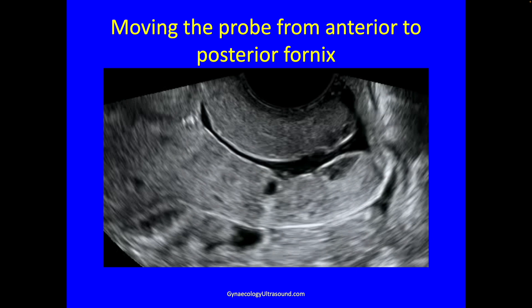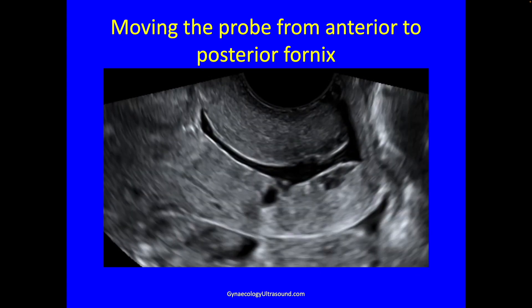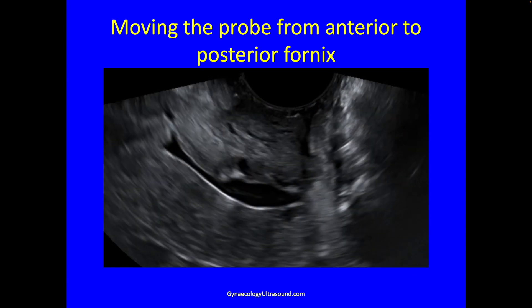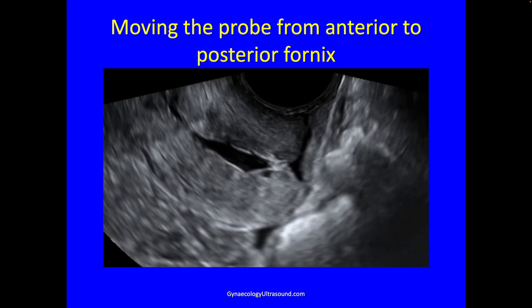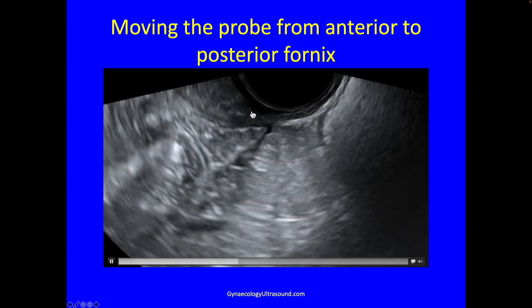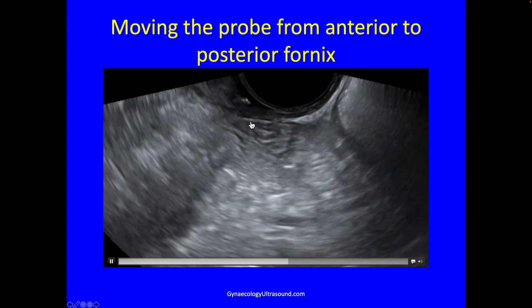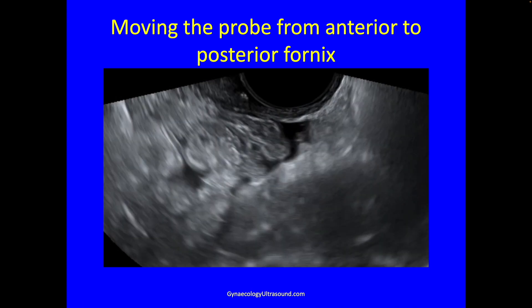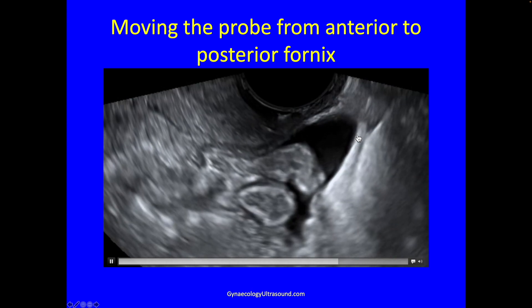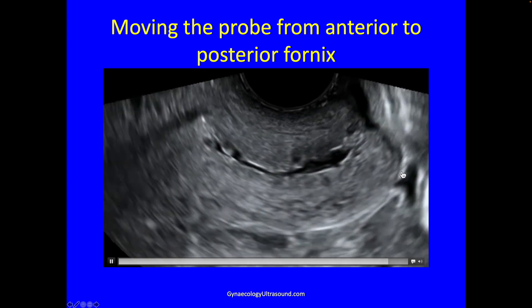So how do we get from the anterior fornix to the posterior fornix in an anteverted uterus? I'll show you how we need to move it from the anterior to the posterior fornix. You just very gently withdraw the probe a little bit, angle it backward toward the sacrum, stretching the vagina over the end of the probe, and here we are in the posterior fornix. There's the cervix, a little bit of free fluid, and then a lovely normal peritoneal reflection, and here we are back in the anterior fornix.